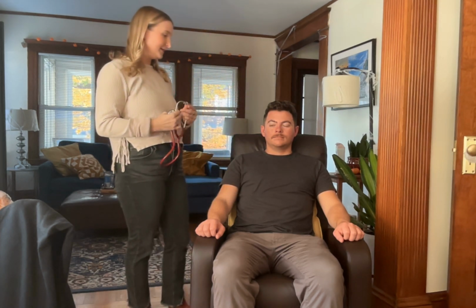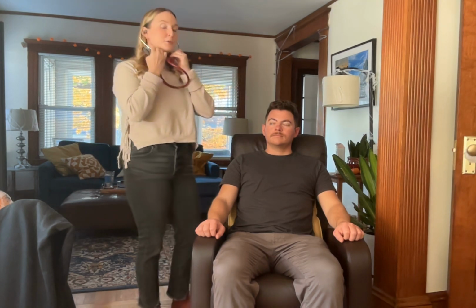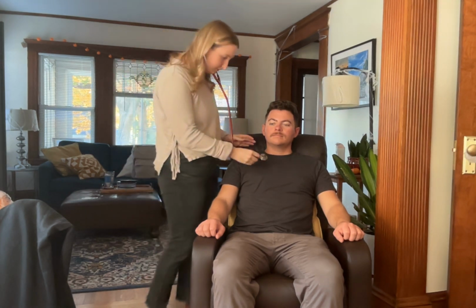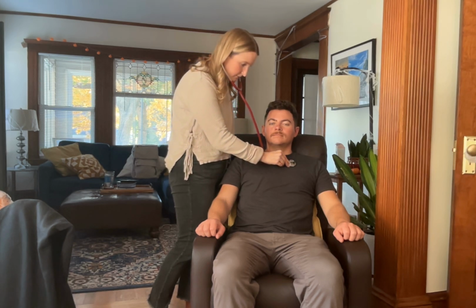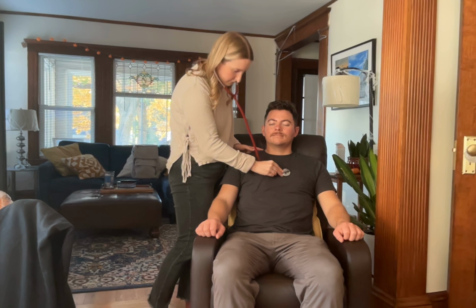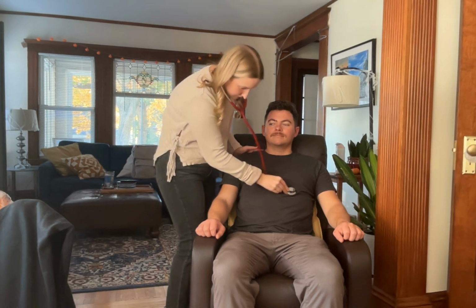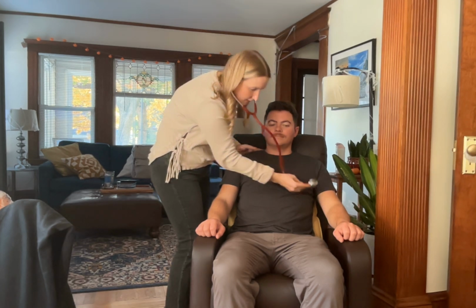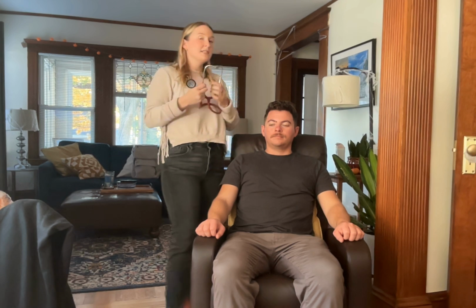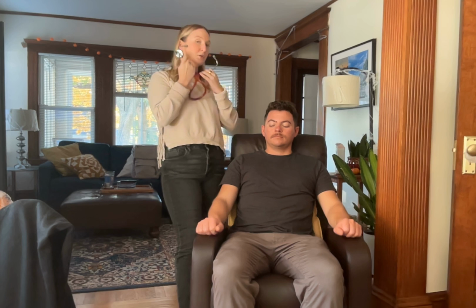I will listen to the heart sounds now. For the purpose of this exam, I will just be showing the spaces I will listen with the diaphragm, but I'll also go through and listen with the bell. So I listen with the diaphragm. I would go through and listen with the bell or apply lighter pressure with this stethoscope so that I could hear the softer pitch sounds heard with the bell.